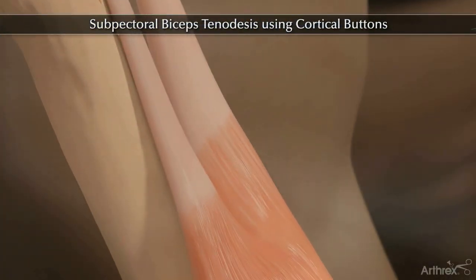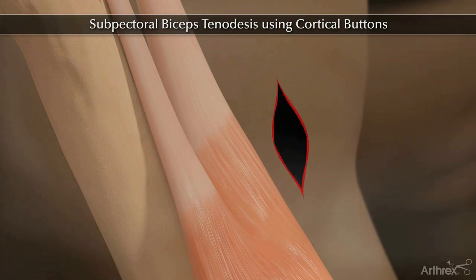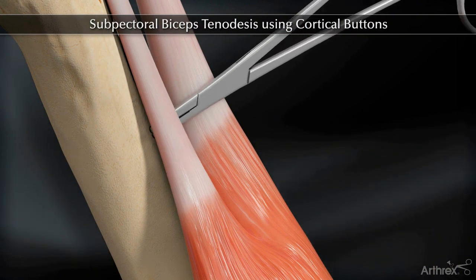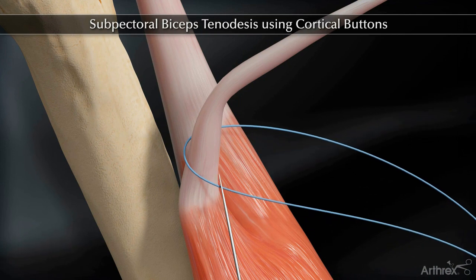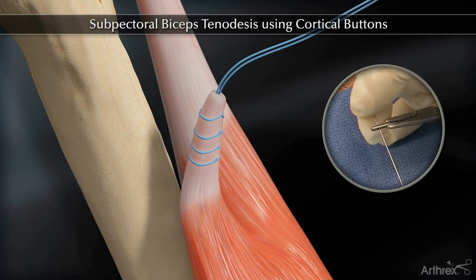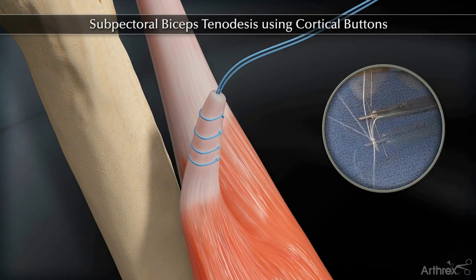Make a two to three centimeter incision in the axilla at the inferior border of the pectoralis major. Whip stitch the biceps tendon approximately two centimeters from the musculotendinous junction using a fiber loop. Thread the whip stitch limbs through the biceps button so the button slides freely on the sutures.